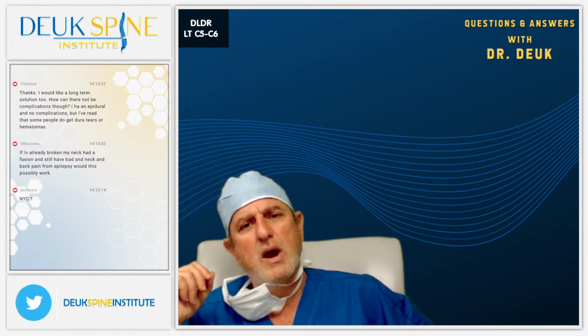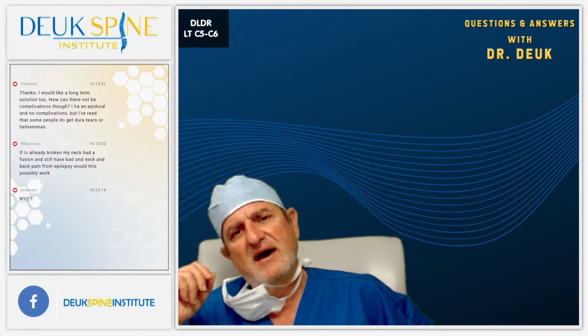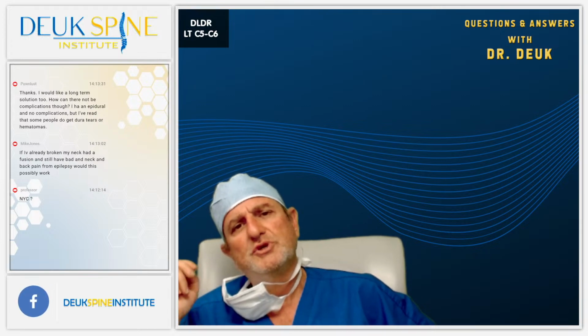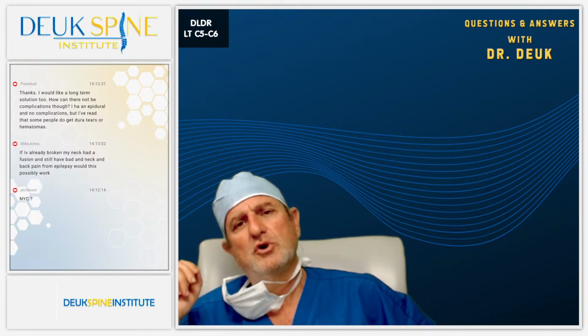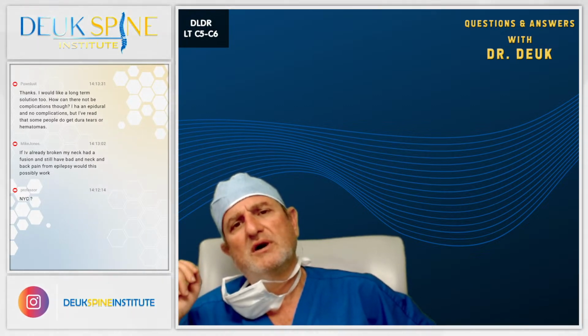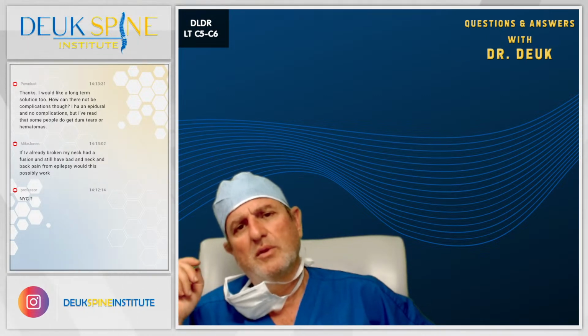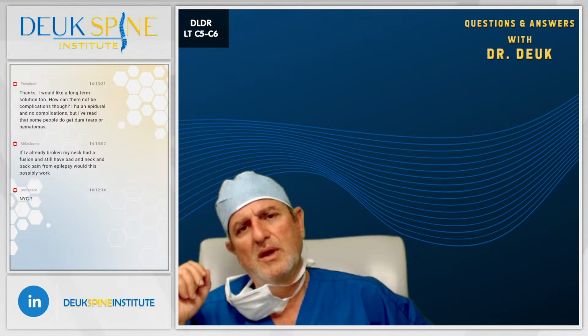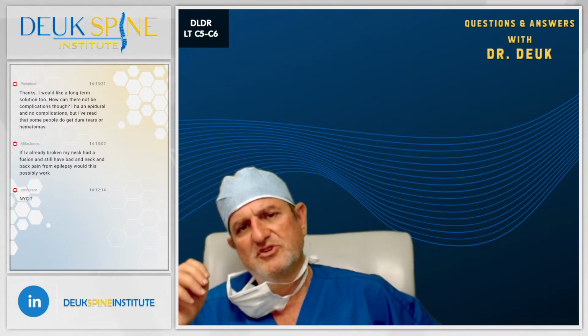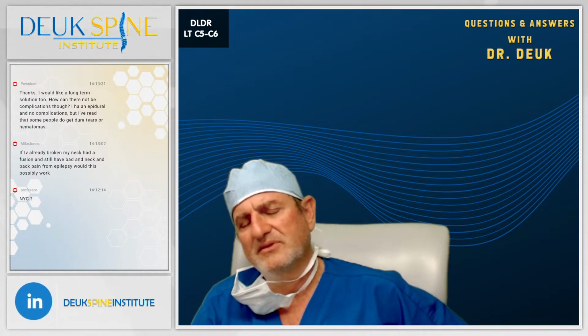The high definition endoscopes that we use have a resolution of 1/20th of a millimeter. Take a millimeter divided by 20. That's the visual resolution of an endoscope at the back of the disc.